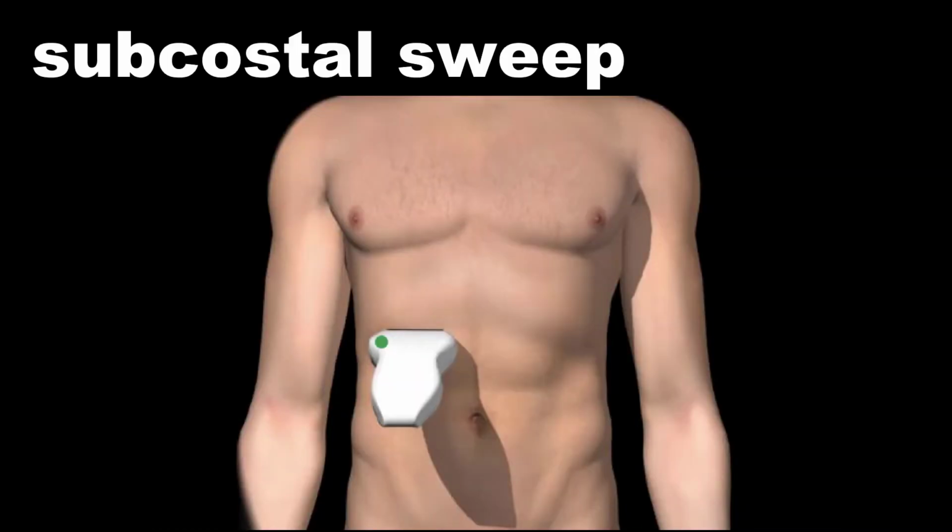Then you'll rotate the probe about 90 degrees so that the indicator is pointing towards the patient's right side, or in line with the indicator on your screen, to get the gallbladder now in the short axis view. Again, press down because you're really trying to sneak the probe underneath the patient's rib cage.